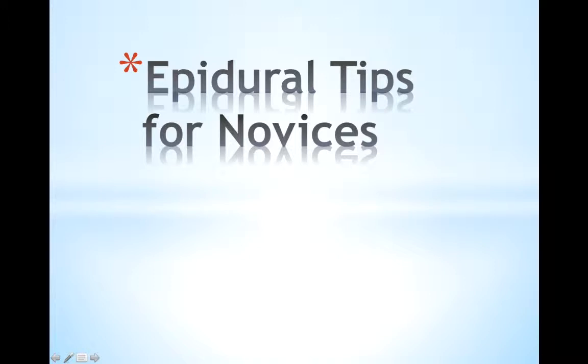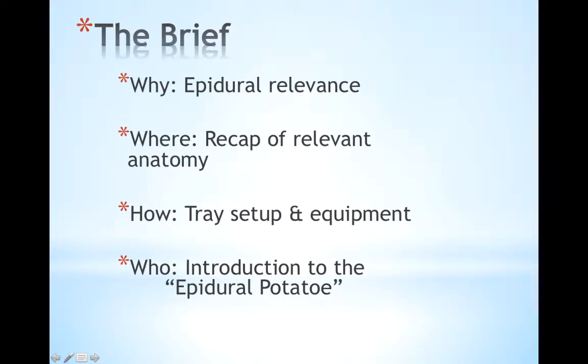What we're going to do is start by just running through what the video is going to cover today. In brief, we're going to have a very quick look at why we're talking about epidurals and why we're talking about how to learn how to put them in. We're going to do a very, very superficial recap of the relevant anatomy. Then we're going to cover tray setup and equipment. And finally, we're going to have a little look at a low fidelity model for practicing the loss of resistance technique for inserting an epidural catheter.